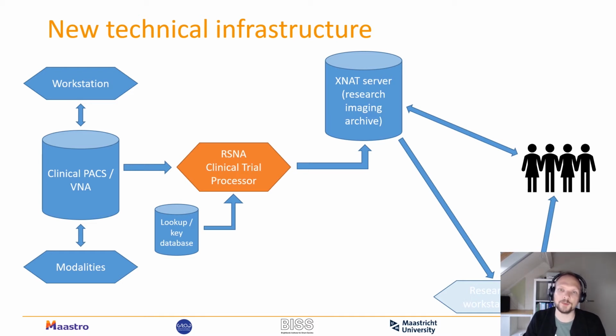XNAT has options to talk the DICOM communication protocol. However, whether all features are included that the research workstation will need, that's unclear for us. So we're currently holding off on making this change, and we'll stay on the previous pattern where we still have that PACS system. Although we would prefer to maybe remove that, as we then don't have the data duplicated twice on the researcher side.